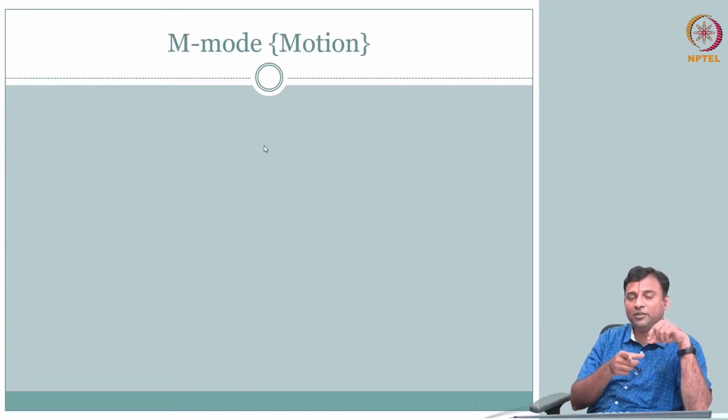The beauty about this mode is, I told you that you get only, at the one location you are sitting, the echoes in the Z direction, in the depth direction, right? That is your A line. So what happens if that interface is moving? I sit in the same location, but there is a motion of the interface.